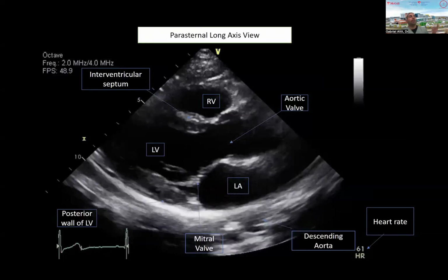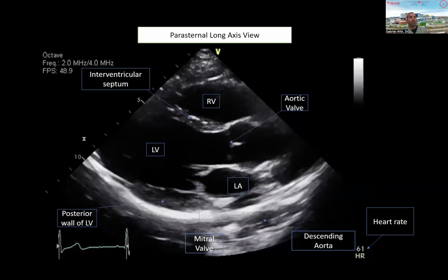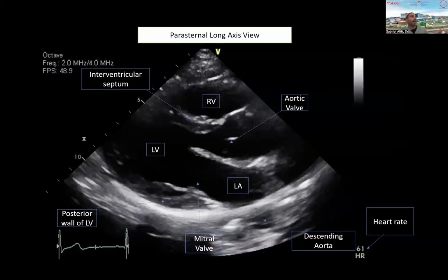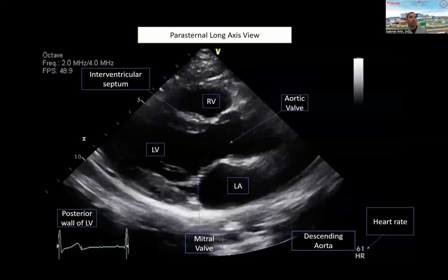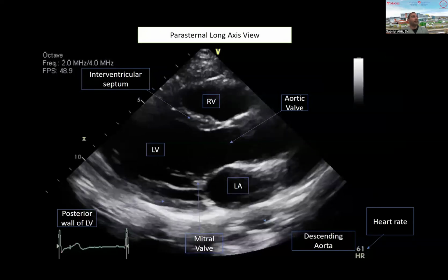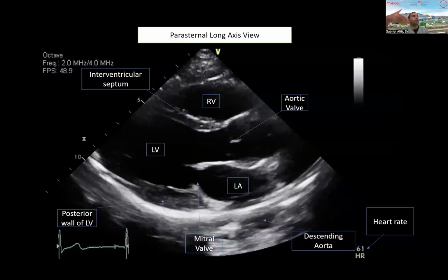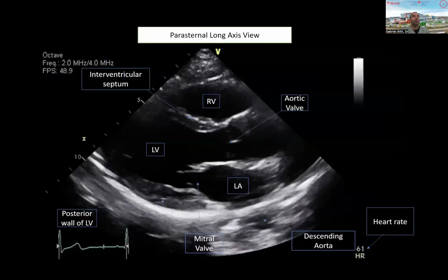If you have obviously a lot of venous dilatation, and so you get pooling in your lower limbs, or if you're very low in preload because you had third spacing, or you bled out, or you have low intravascular volume, the RV gets less fed, and because it gets less fed, eventually your pulmonary blood flow drops, and eventually your LA gets less preload as well.